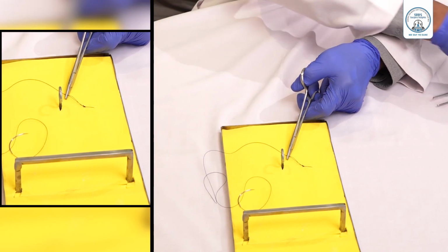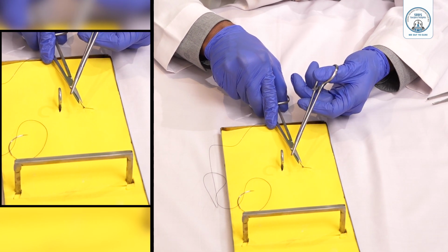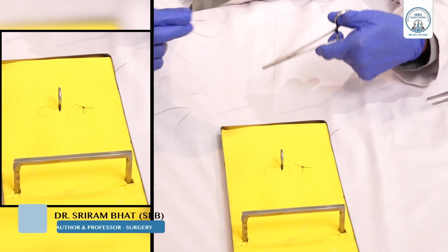Then after that, you have to cut the thread near the knot like that, holding it like this. Usually the assistant should cut it like this. So this is a simple interrupted suture. It's a basic suture actually.